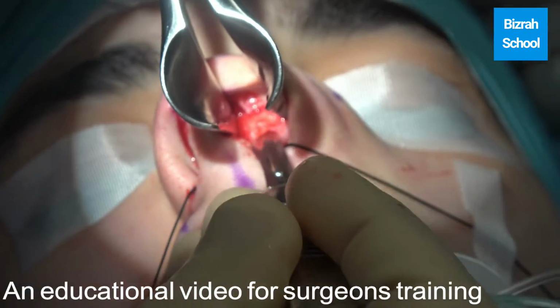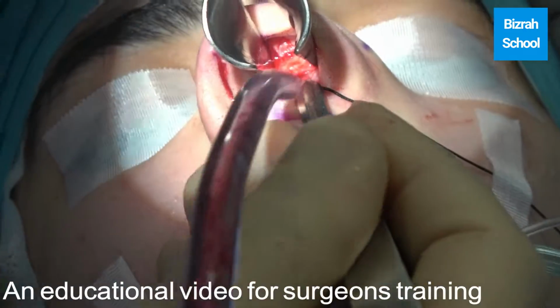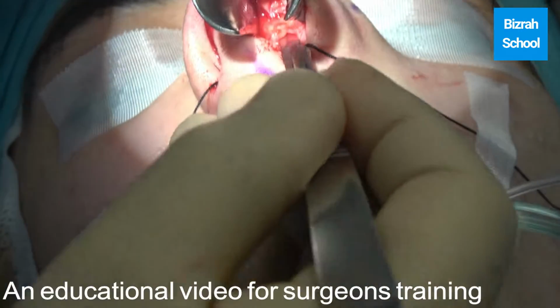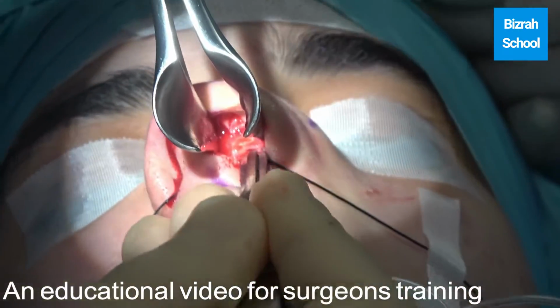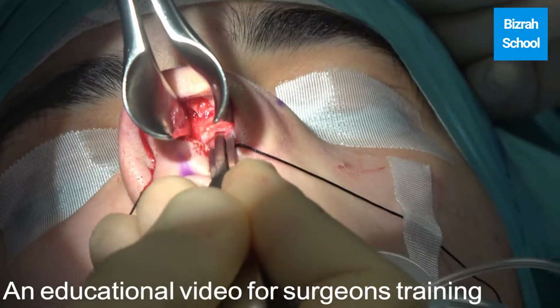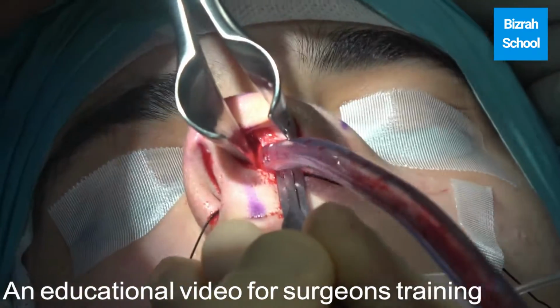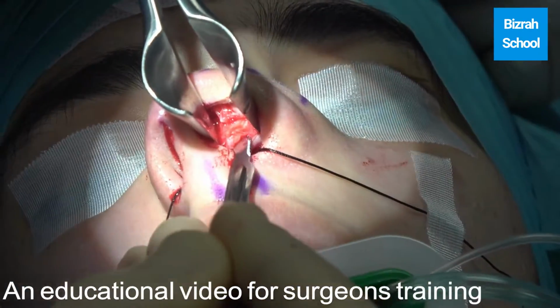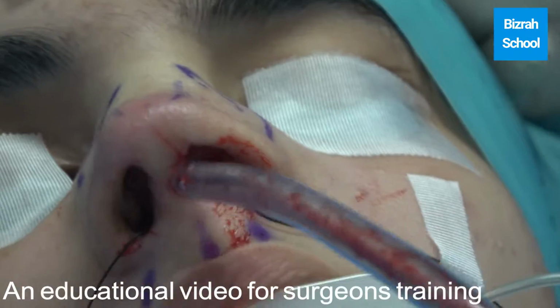Just lateral to the junction between the upper lateral cartilage and the dorsal septum. So now I've got nice pockets there. All my knife is in. You see now I'm going up and down, and my knife is in, between the mucosa and the cartilage, and then get the spreader graft.